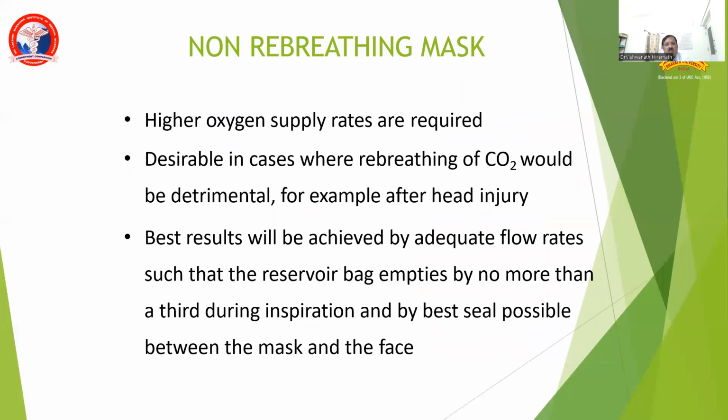Higher oxygen supply rates are required. If that is not maintained, there is a possibility of rebreathing carbon dioxide, which is detrimental.